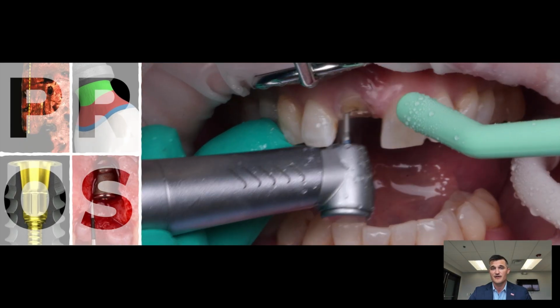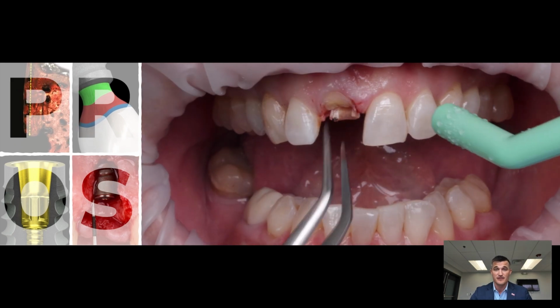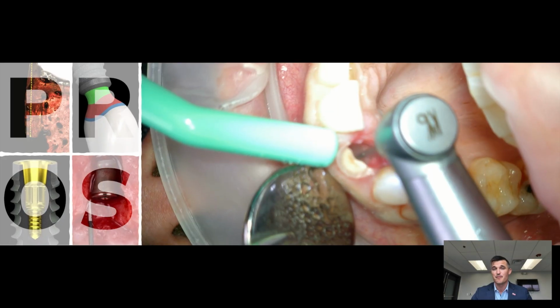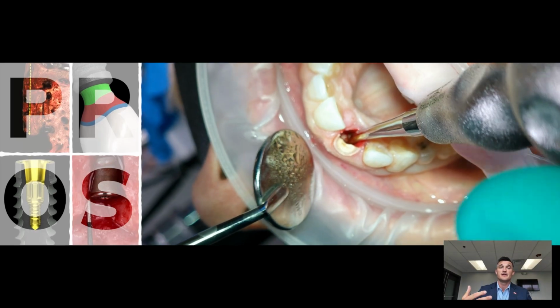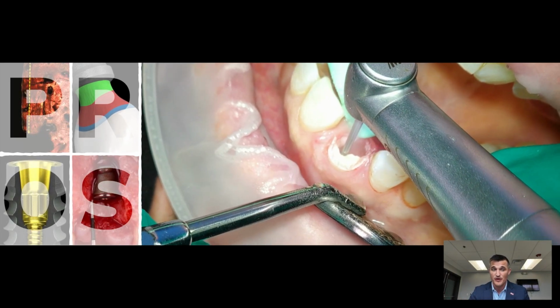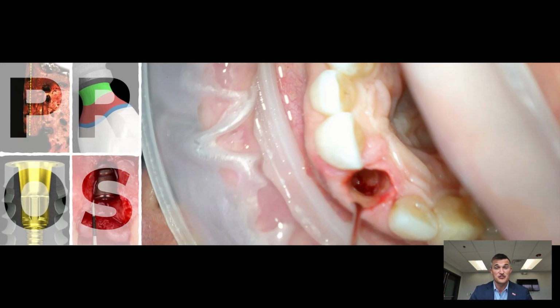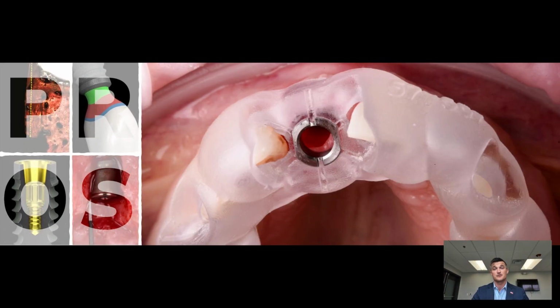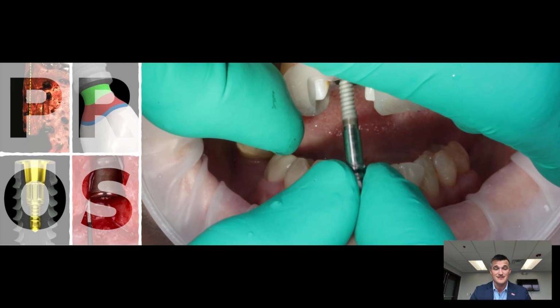When you think of platform switching, I mentioned that it increases tissue thickness at the platform level of the implant. Restorative design, I mentioned the aesthetic biological contour concepts. That bounded zone is space for connective tissue. So it's providing stability to the tissues by increasing their thickness, which provides more blood supply, which allows for more stability. Optimal connection, having a stable suprastructure, is going to increase the space for those tissues because tissues can deposit further on the platform. So again, it increases tissue thickness and stability.